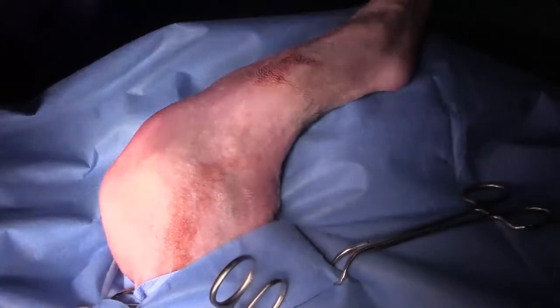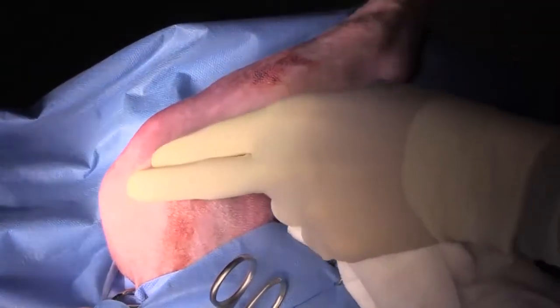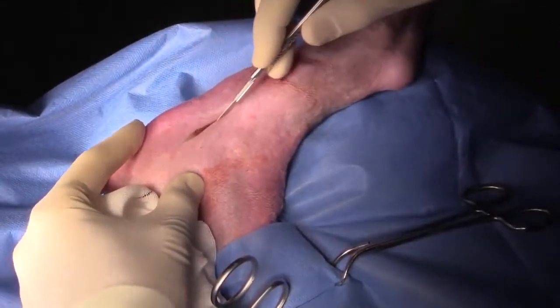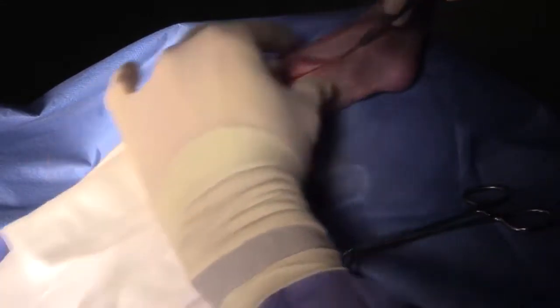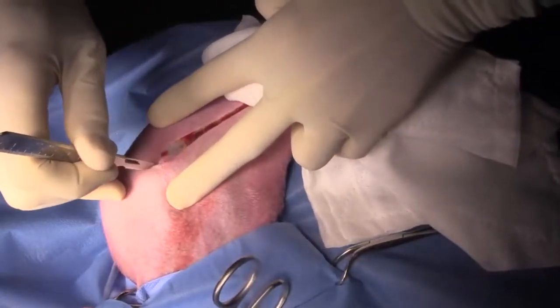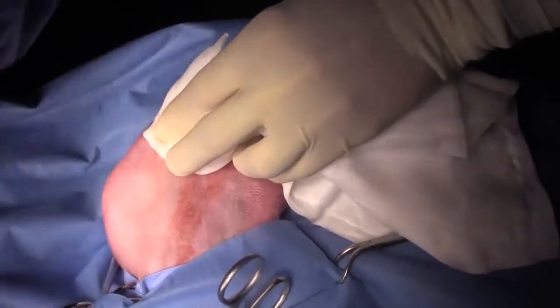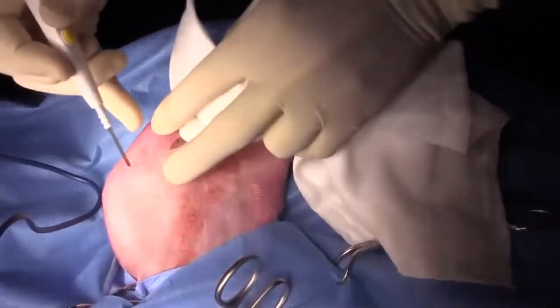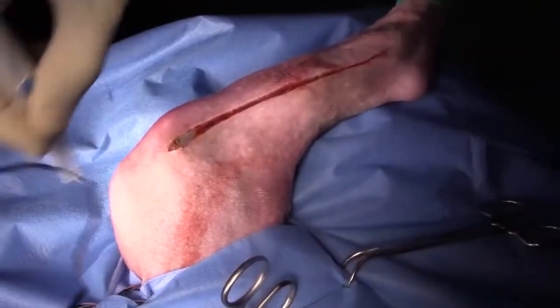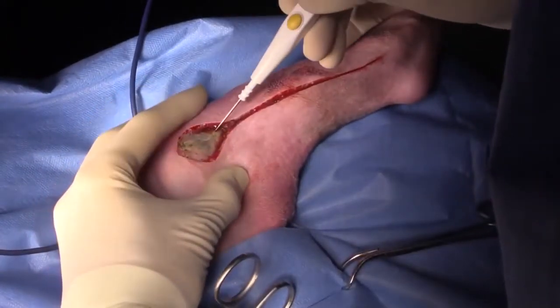Almost identical fracture. I've posted the pre-op radiographs on the community discussion page, so if you want to refer to that you can see exactly what we are dealing with. We're making a medial incision to the tibial shaft. You really have to repair almost every tibial fracture through a medial approach because there's muscle covering the rest of the tibia. So that is the approach of choice.